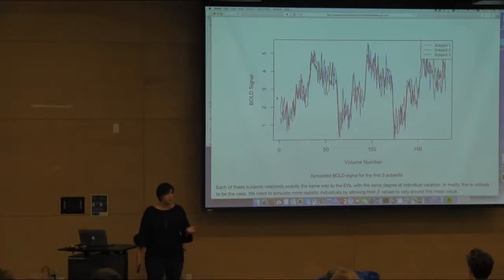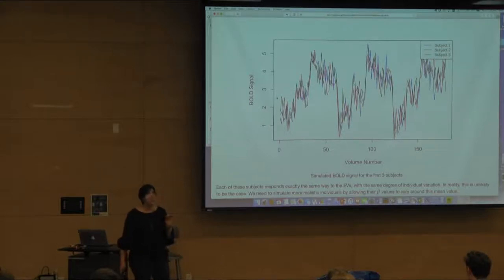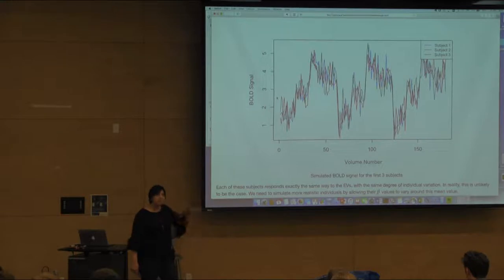So you're likely to see, you know, an N-back 1 and have maybe a different response compared to baseline than somebody else in the room, right? And that would mean having a different beta weight for that particular condition. So what we're not accounting for here is the between subject variance. All subjects are behaving exactly the same except for that within subject random error, which was in fact the same too for each person, right? So that's why these look so relatively beautiful. There's a pattern to each of these that they're following along within some error, but that's not what fMRI data ever looks like, right?